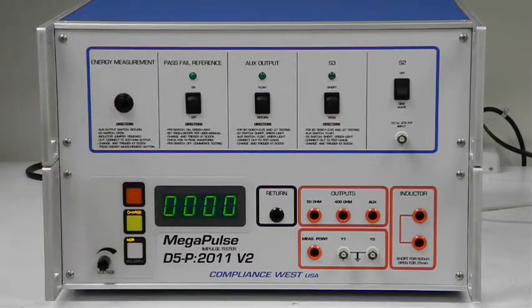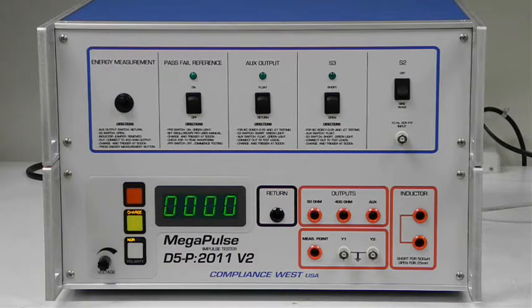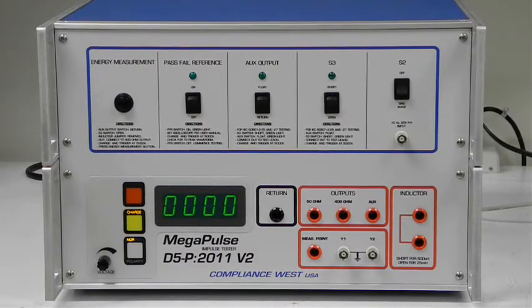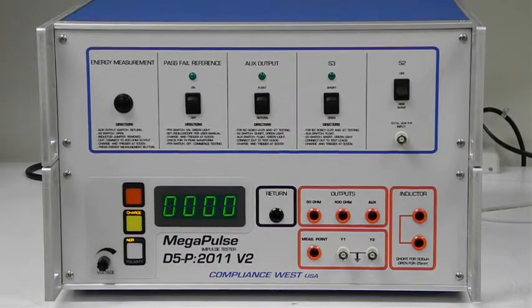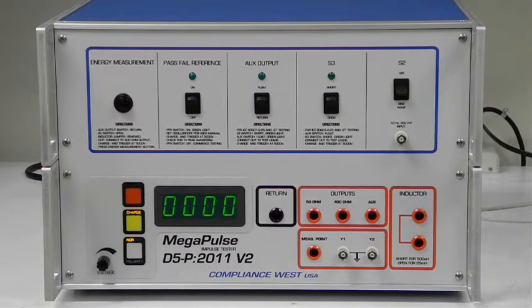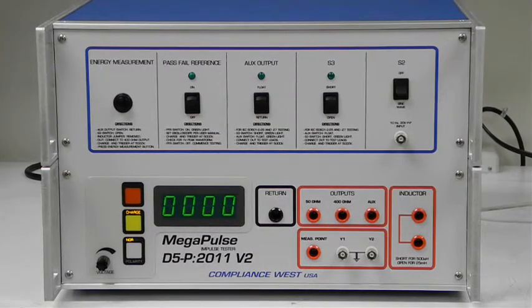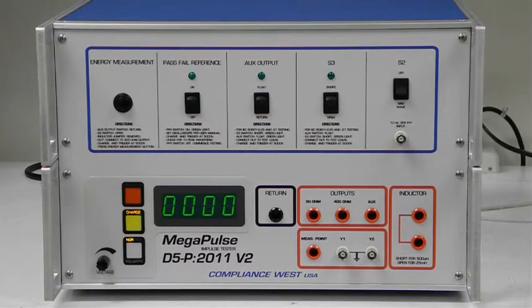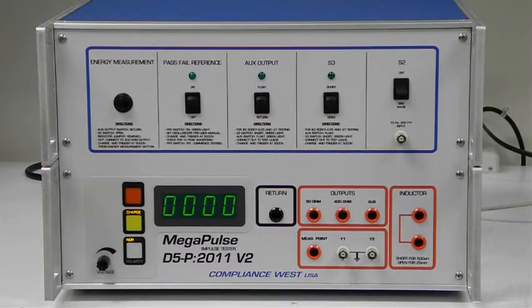After the charge has been delivered, the energy in joules dissipated in the 100 ohm resistor for the last pulse delivered will be displayed when the energy measurement button is pressed.